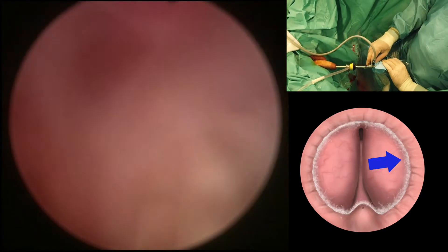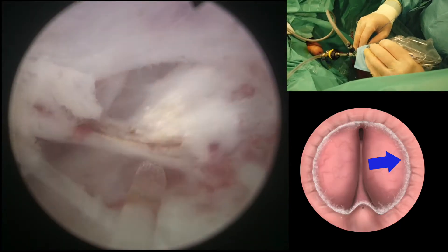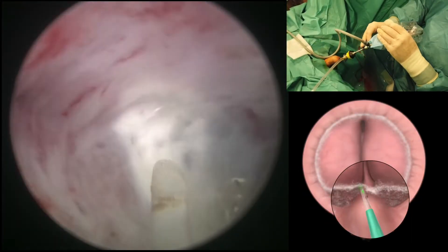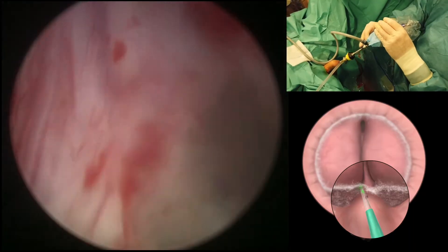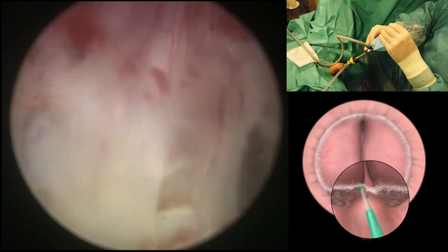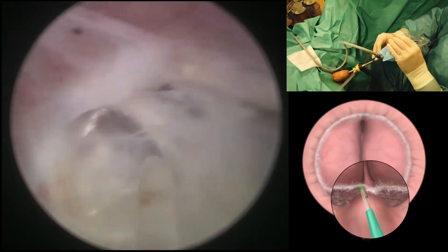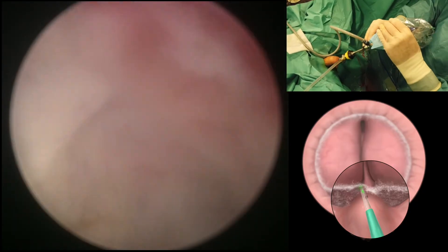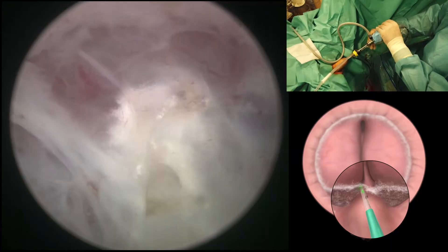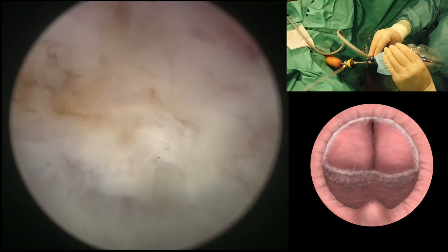This is the marking of the white line — a circumferential line that demarcates the limit of the apex with the limit of the adenoma. Then we have to connect both lateral apical planes in the midline by cutting the frenulum of the veromontanum to connect the two lines of dissection, the two lines of attack that we have demarcated apically.